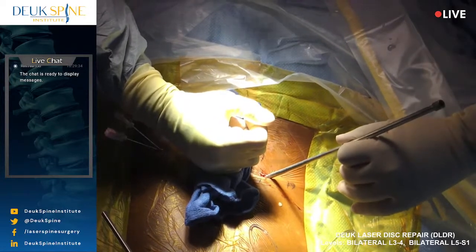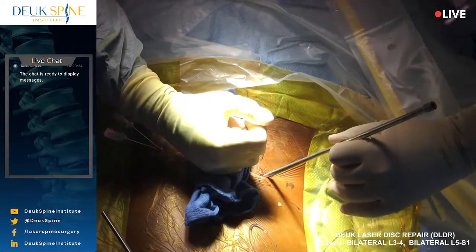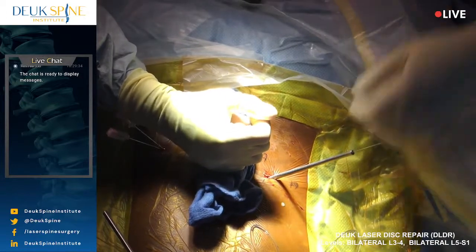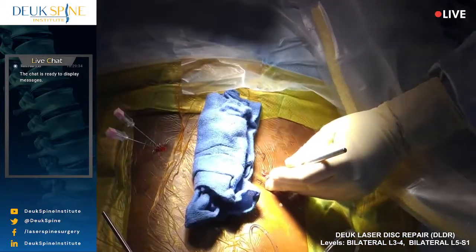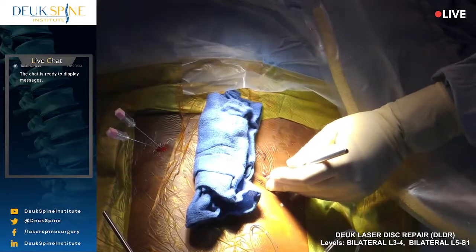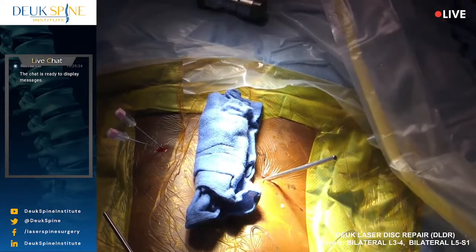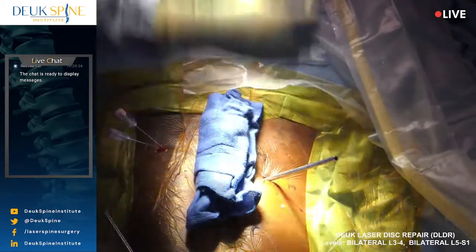I can feel that herniation. It is massive. Yeah, it's big. Shot? All right. So I'm constantly maneuvering to get the right angle. I felt the herniation go back in. Look at that. Amazing.